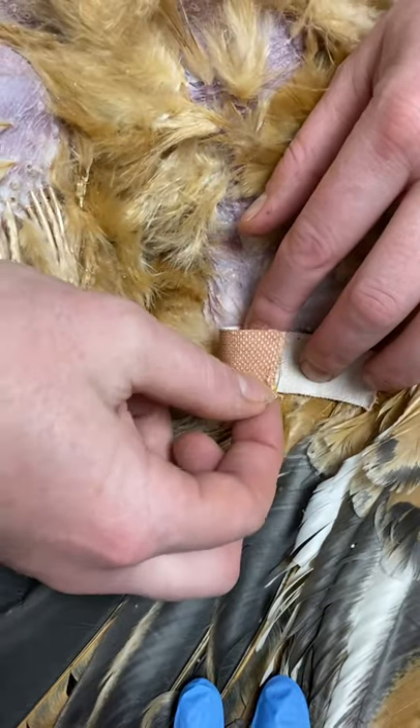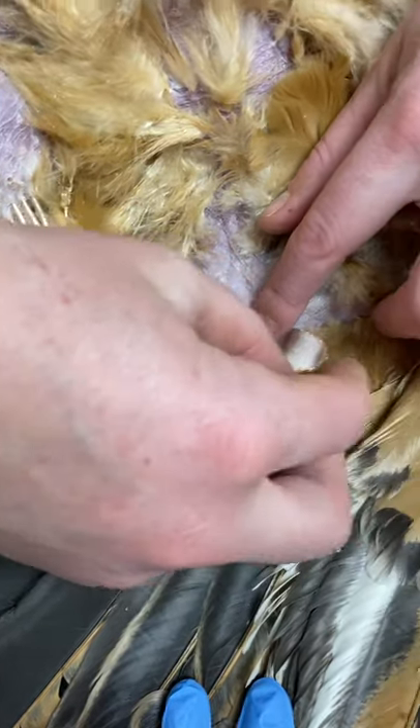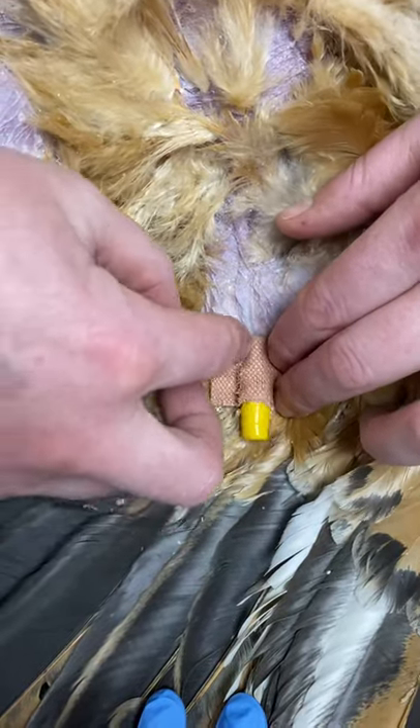So we fold over one side, squidge down the edges, we then want to fold over the other side and again squidge down the edges, keeping everything as close to the body as possible.